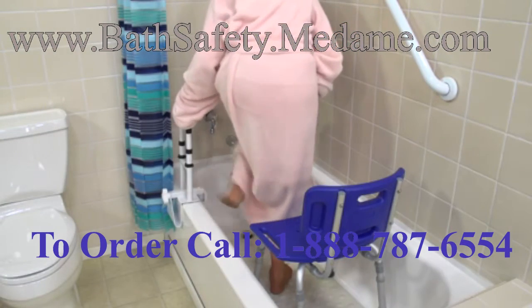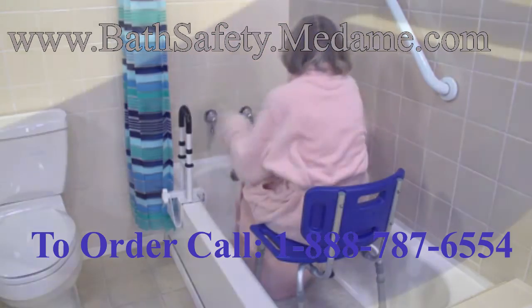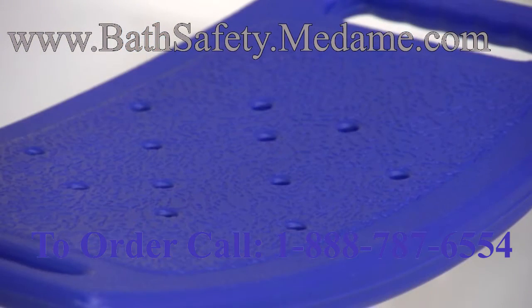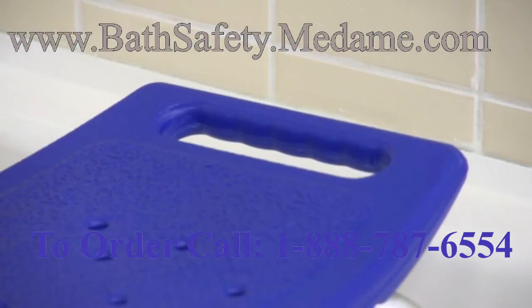This lightweight aluminum frame is corrosion proof and strong enough to support up to 400 pounds. These drainage holes reduce slippage. The contoured seat provides maximum comfort, has handles for added security and is easy to clean.